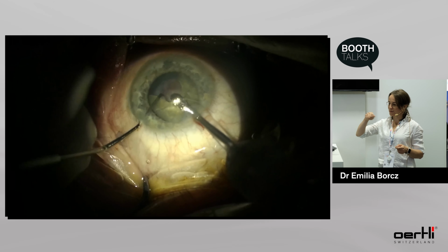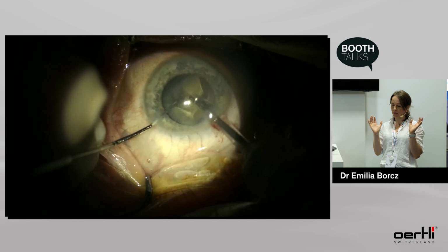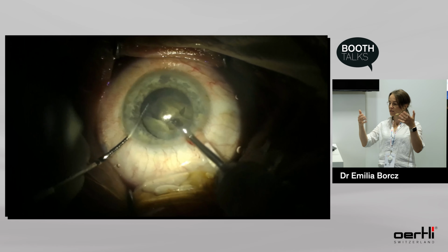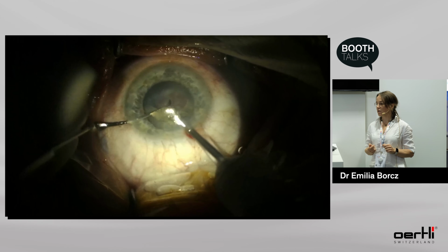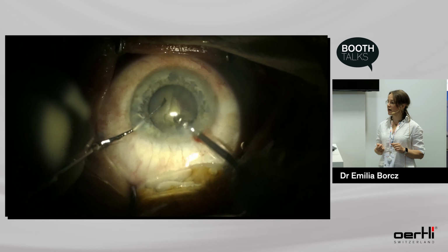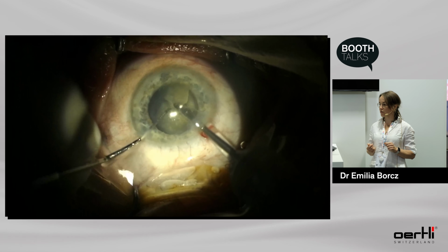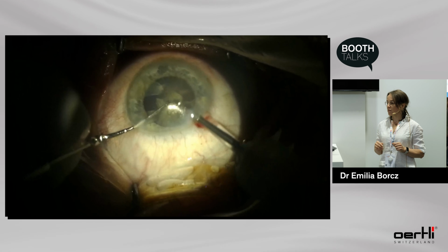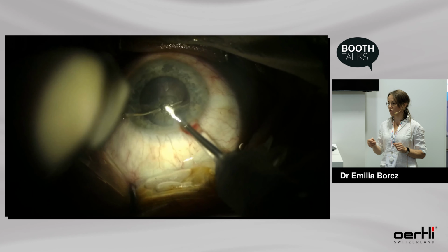I do like this movement. This also enables fluid to circulate in a better way. And with good hydrodissection, the fluid goes under the lens and it just comes into the opening. So part of the lens is already left here, but we can still work very safely because we have very nice anterior chamber stability.